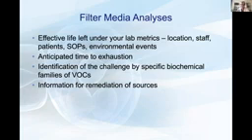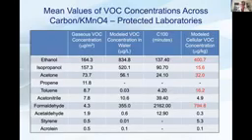just gives you an idea of anticipated time to exhaustion of that filter, because obviously you want to be proactive in changing those out. Some of the assays will also identify which biochemical families have challenged that particular filter. And then that can help you identify those particular sources of VOCs, and again, take actions of remediation.